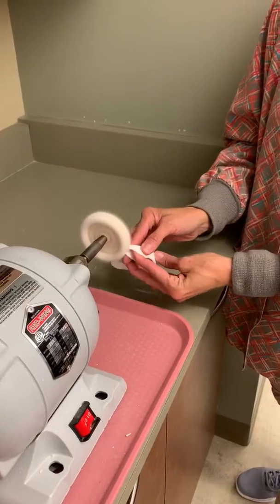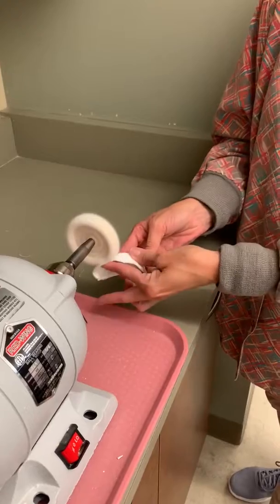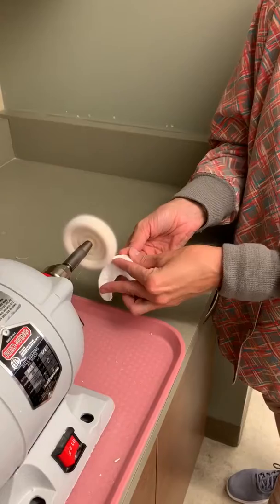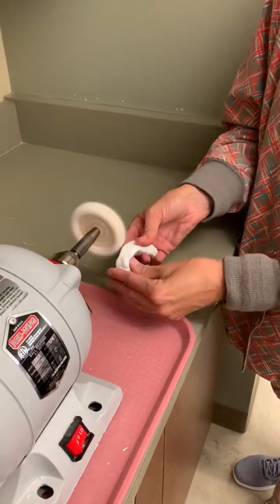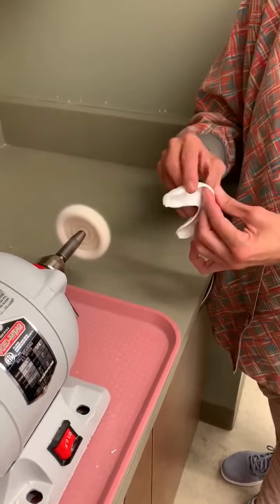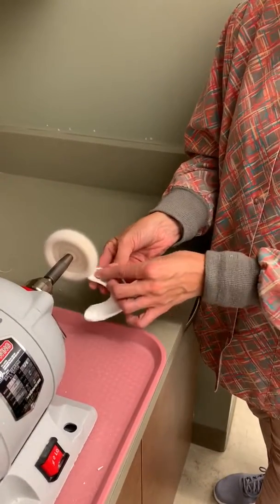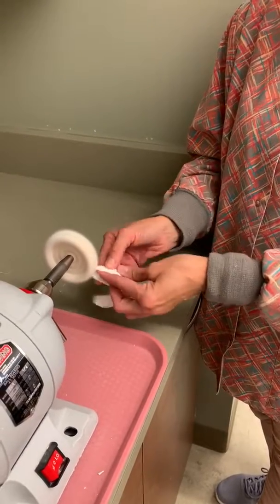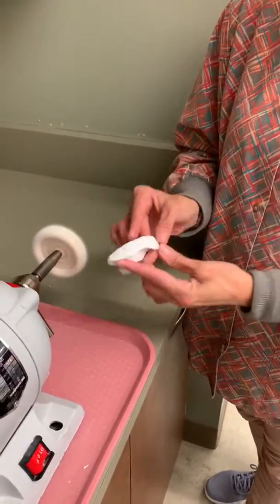I'll just do a little section of it and then pass it around so you guys can feel the difference. It also helps to get rid of any marks that might have gone onto the white material while you were torching it or cutting it. You don't want to do too much to make it too thin, just enough to take away that sharp edge.